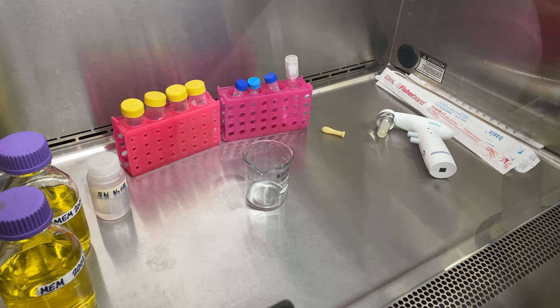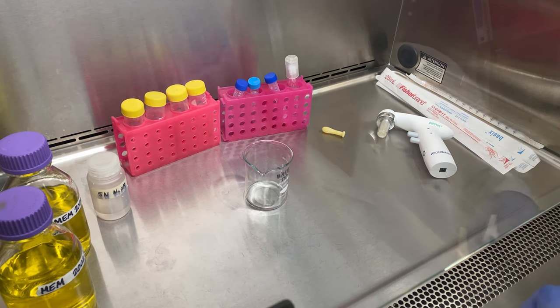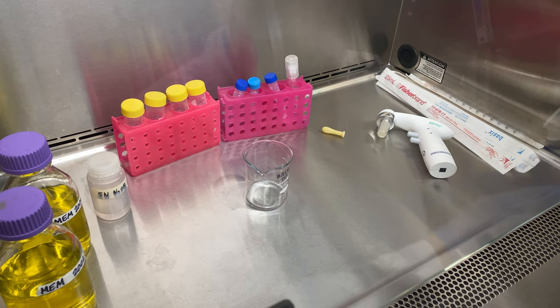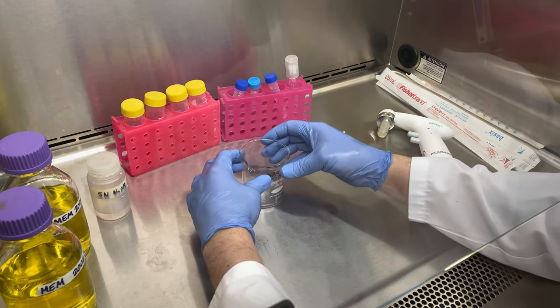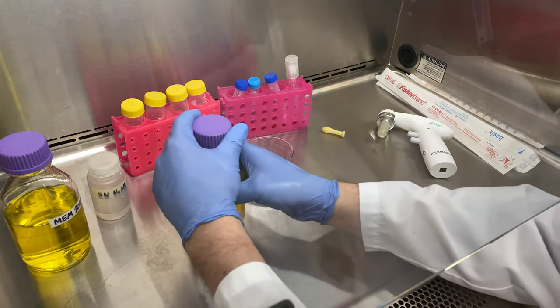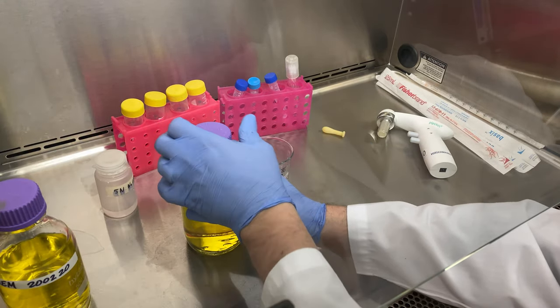Welcome to my lab. In today's lab we're going to finalize MEM — minimal essential media. We've added all the essential components that can be autoclaved, autoclaved it to sterilize it, and now we need to add in some new components that could not be autoclaved. They've been filter sterilized and we'll add them in now.